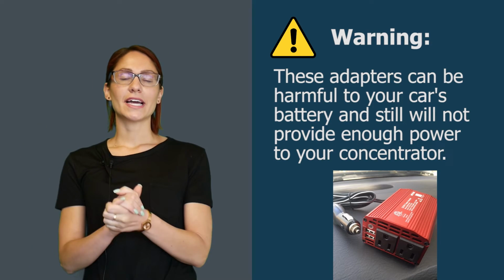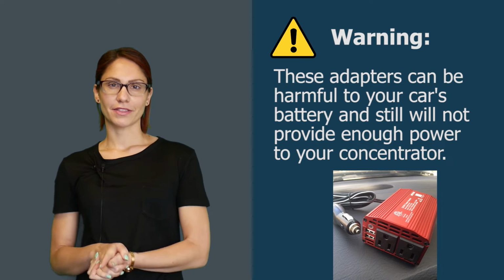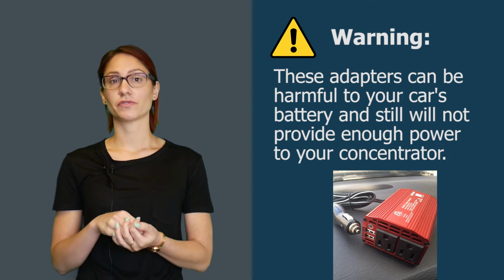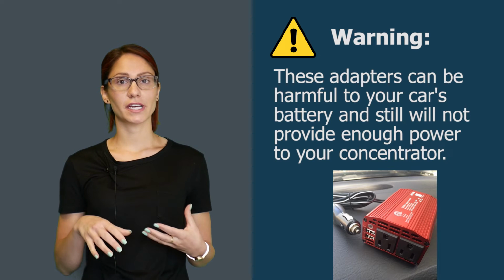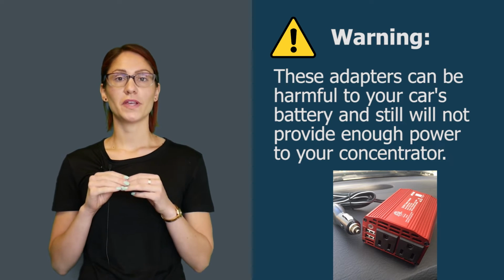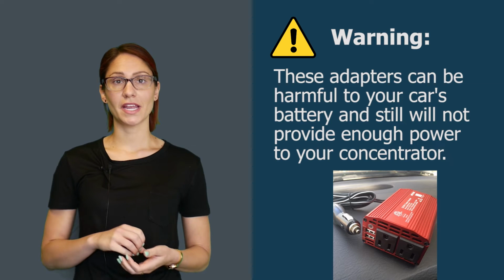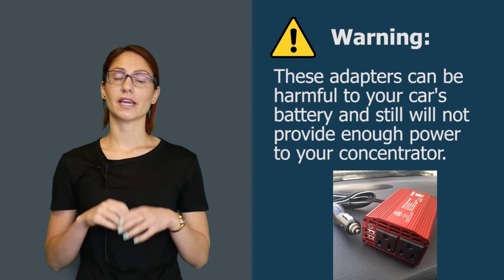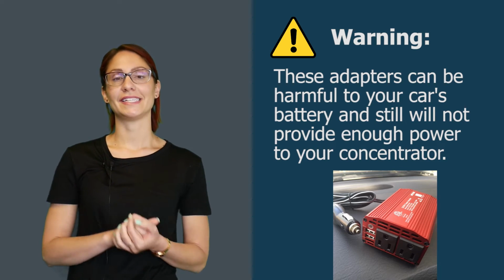Okay, and just a note for you MacGyver types out there, if you have put a 110 outlet in your car and are trying to run not a portable but a stationary concentrator out of that, we do not recommend this. This will drain your car power very, very fast. So make sure that you're using a portable concentrator with a DC outlet.